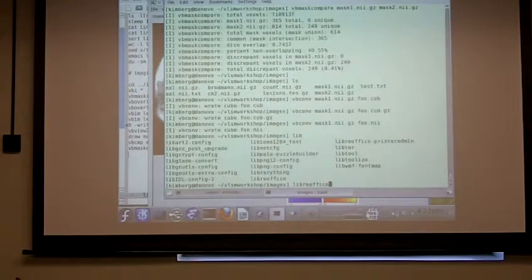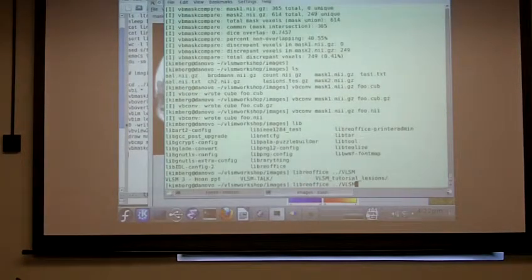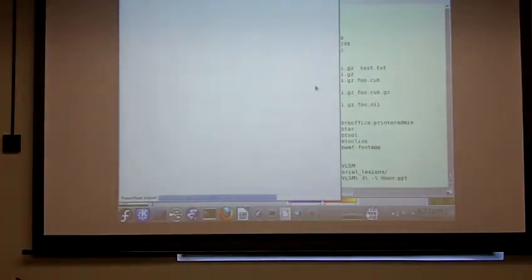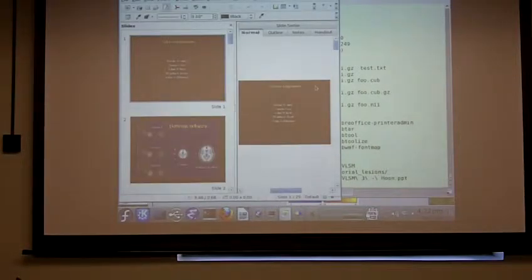Before you turn it over to me, the transformation, you said it's stored in the Nifty file. It's quite confusing. Where in the file is it stored, like in the header, or how can we find out, or can we manipulate it somehow?